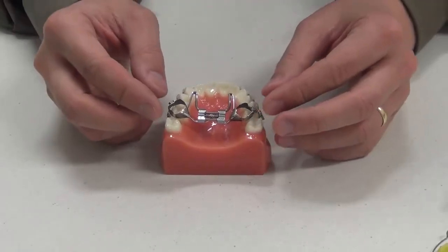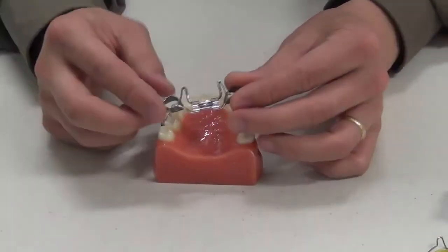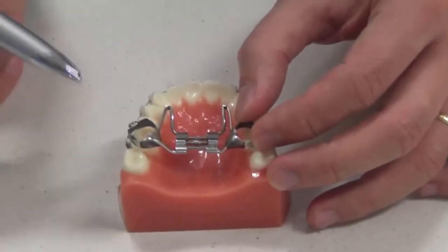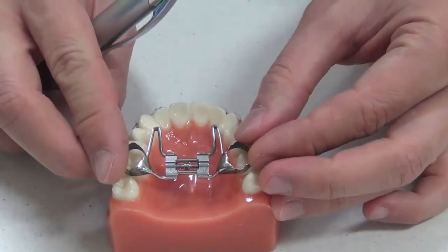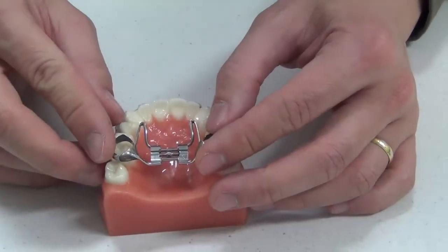Today I'd like to talk about fixed expanders and how to turn these expanders. This expander is a type of plate which is fixed in place, seated around the back teeth along the top. The aim of this is to widen the upper jaw. So we have an expander in already and now we're going to look at how to start turning it.